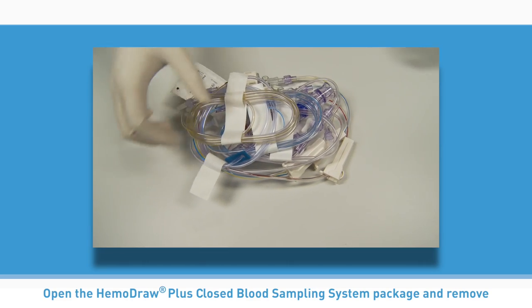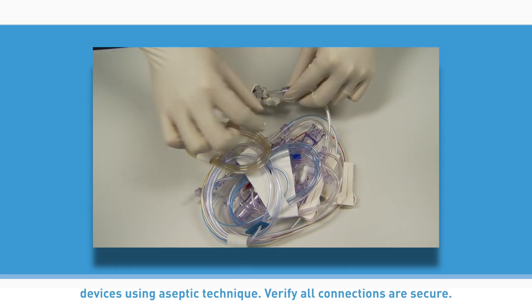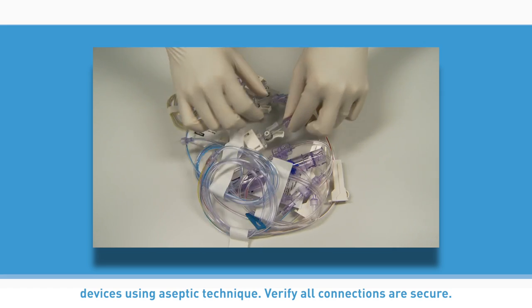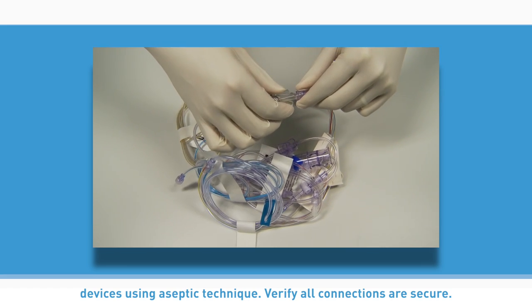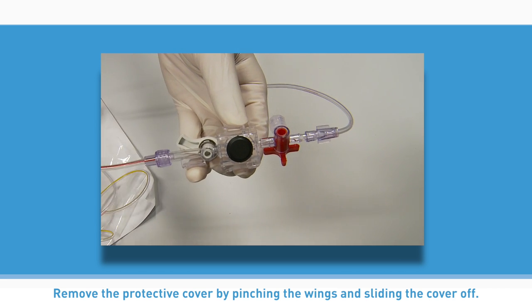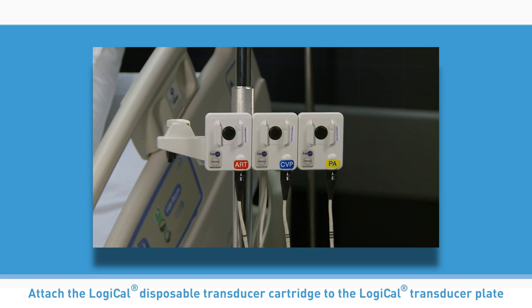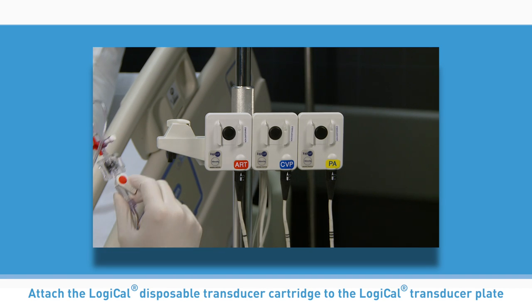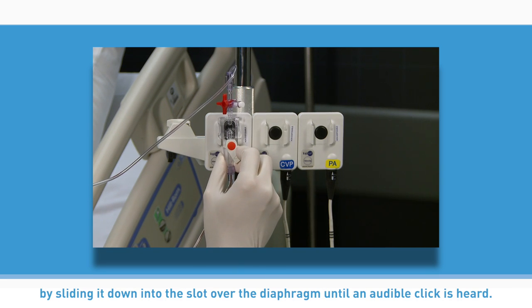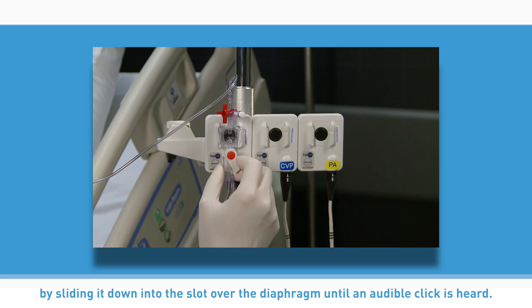Open the Hemodraw Plus closed blood sampling system package and remove devices using aseptic technique. Verify all connections are secure. Remove the protective cover by pinching the wings and sliding the cover off. Attach the Logical disposable transducer cartridge to the Logical transducer plate by sliding it down into the slot over the diaphragm until an audible click is heard.